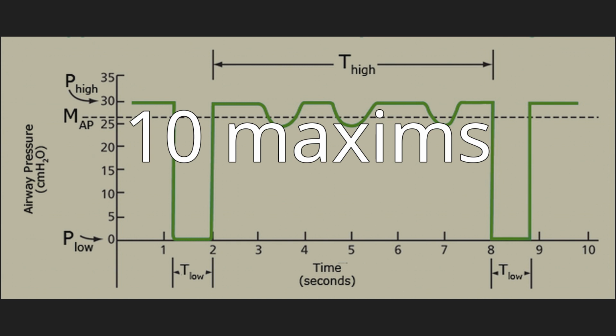A ventilator assists breathing using either pressure control or volume control based on the equation of motion for the respiratory system. Providing assistance means doing work on the patient, which is accomplished by controlling either pressure or volume. A simple mathematical model describing this fact is known as the equation of motion for the passive respiratory system. Pressure equals elastance x volume plus resistance x flow. In this equation, pressure, volume, and flow are all continuous functions of time.